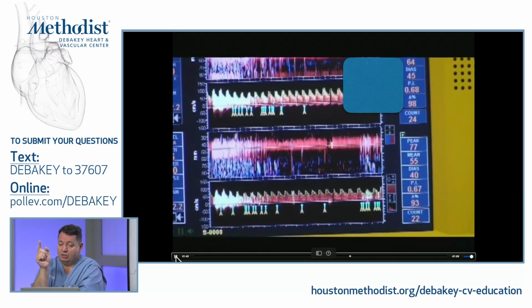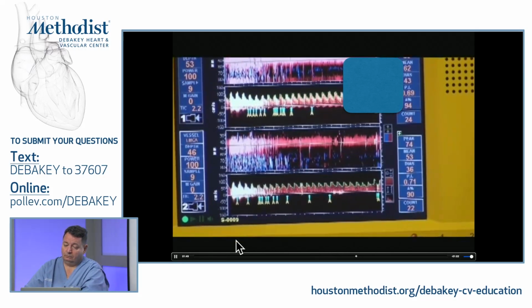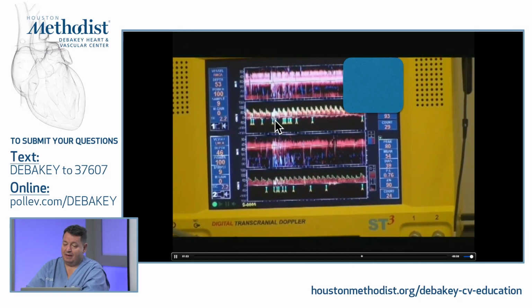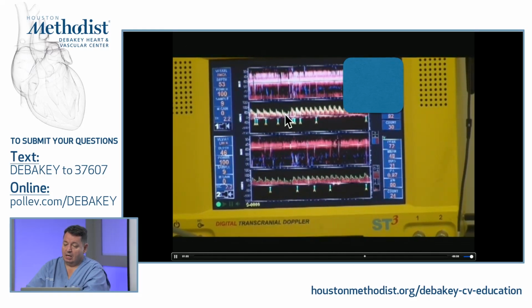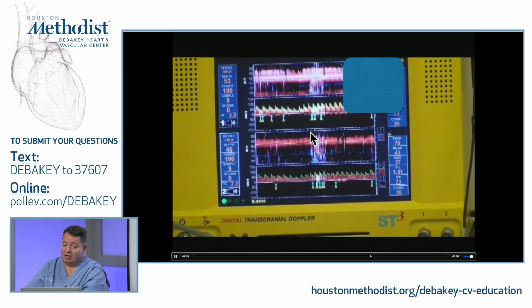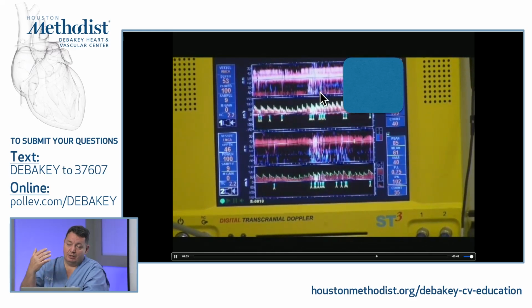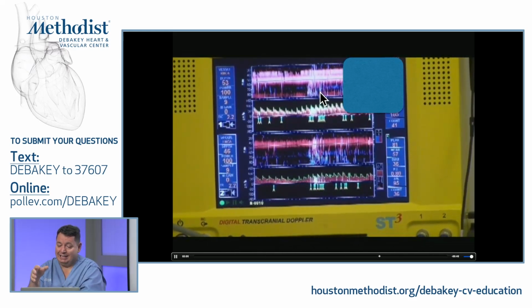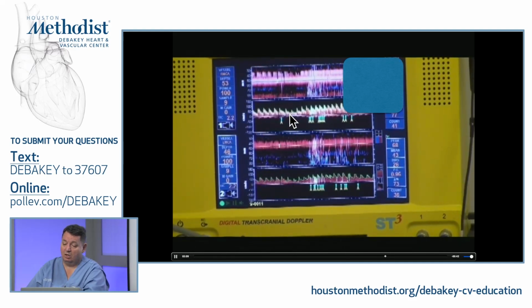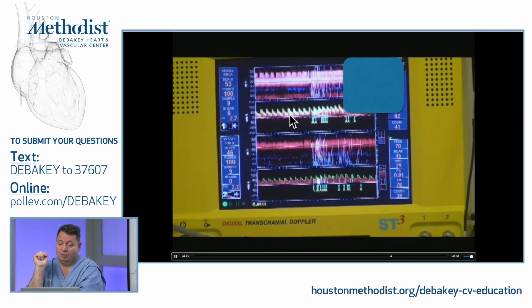Now I'm going to ask to do this Valsalva. Hold it, bear down, push, push, push, push. And the Valsalva needs to be 5-6 seconds, and you see the waveform has changed. And it's released, and a Valsalva release brings you more bubbles. And the patient could experience lightheadedness, so this is why the depth of the Valsalva really goes down to 0. You quickly ask them to release. You don't want them to pass out on you.